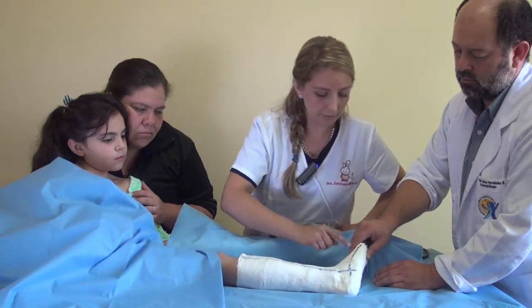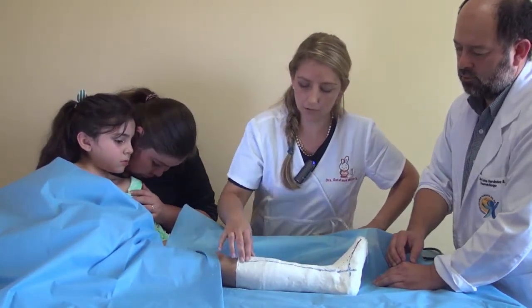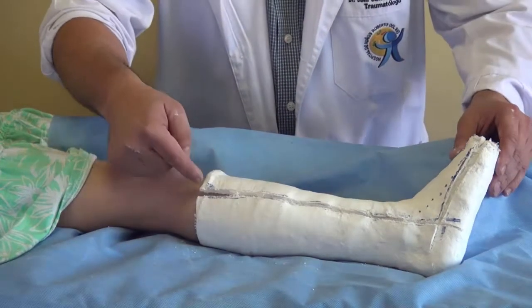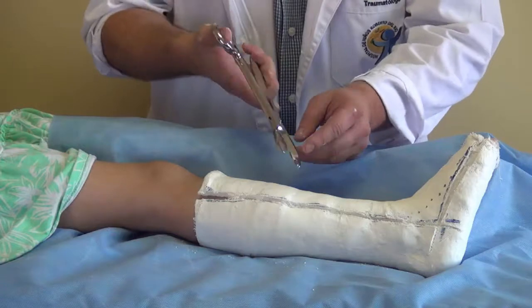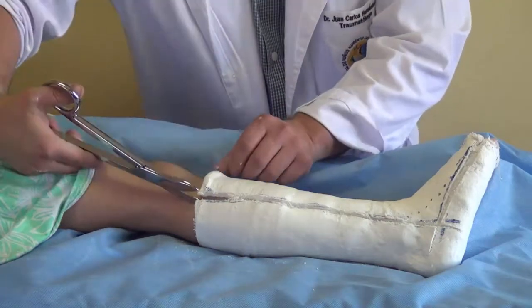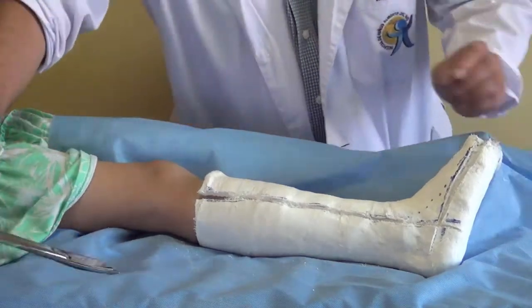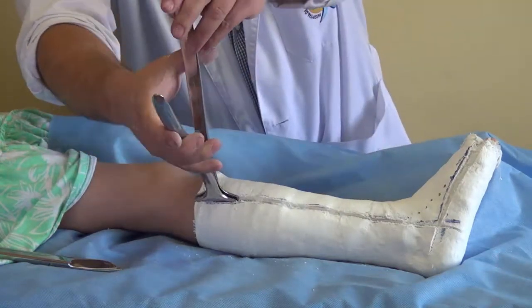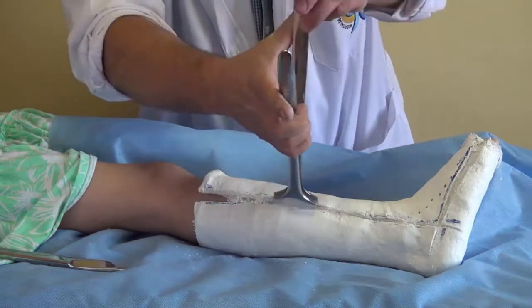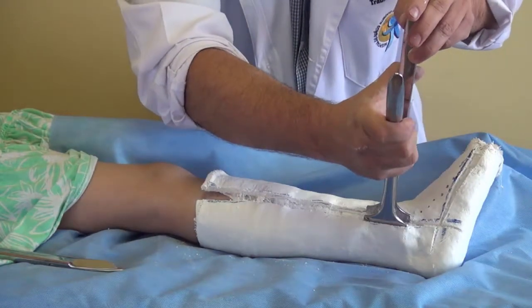Be very careful here. Then you cut the end of the foot and take it out with the spreaders. Once we are ready with the cast remover, we use the special scissors with the protection on the end to cut the ends of the cast. Then we use the spreader, put it into the cut, and spread it open — there are many ways to make a comfortable removal for the patient.